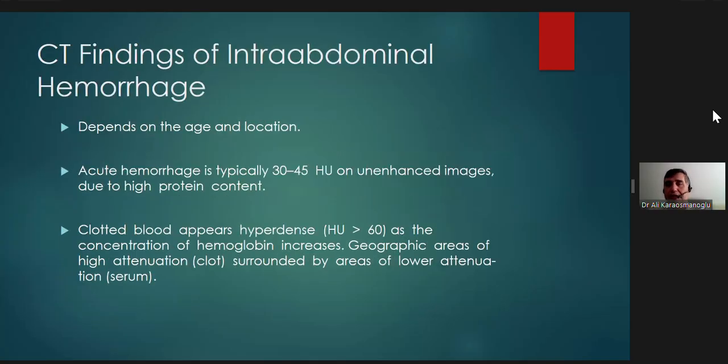So, CT findings. I want to highlight the CT findings because it's the workhorse modality in the ED, as you all know. It's kind of a stethoscope now, right? I'm sure it's the same in your hospitals too. The emergency physicians, the surgeons, all types of surgeons, are so reliant on CT for diagnosing acute intra-abdominal conditions and triaging the patient accordingly, whether to surgery or conservative treatment.